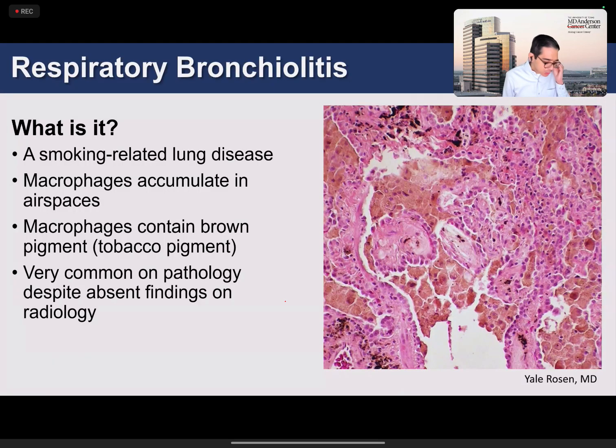So this differential that I'm about to give you is more for chronic ground glass opacity. The previous one was for chronic consolidation. And I'll just say that this differential for chronic ground glass opacity is, I don't think, as useful as the chronic consolidation one, because ground glass opacity can be so many different things, right?